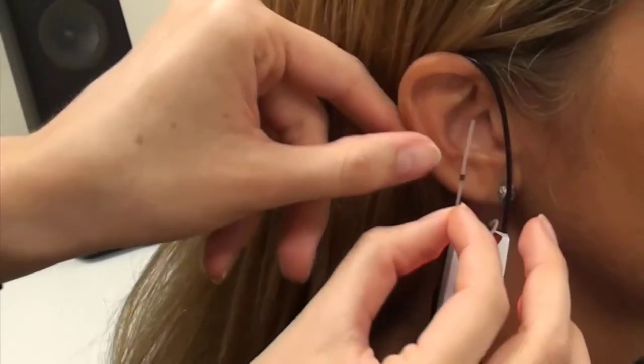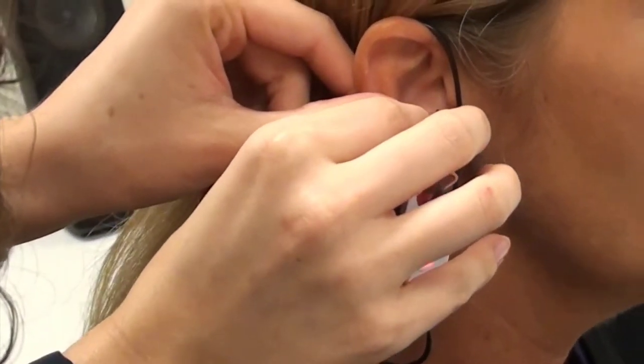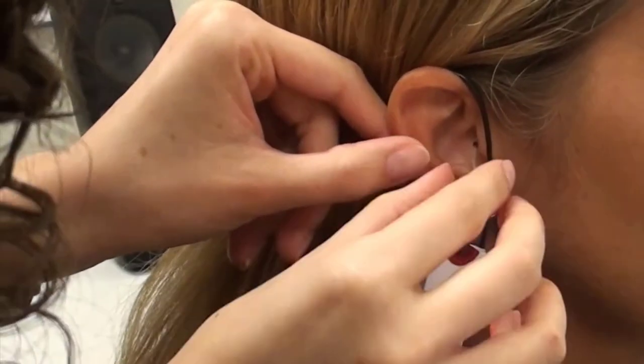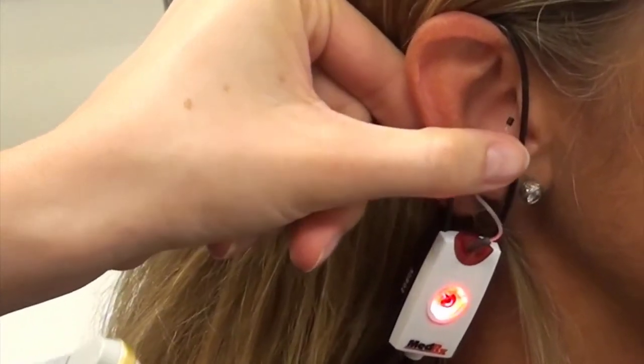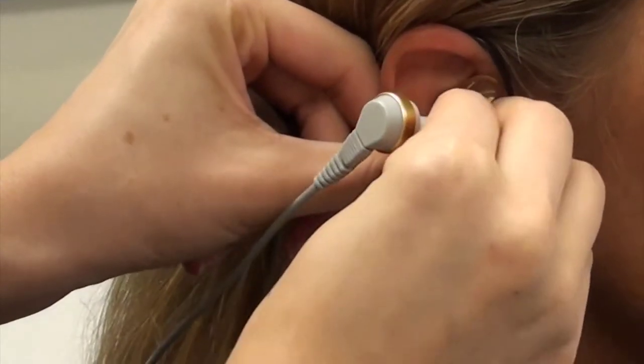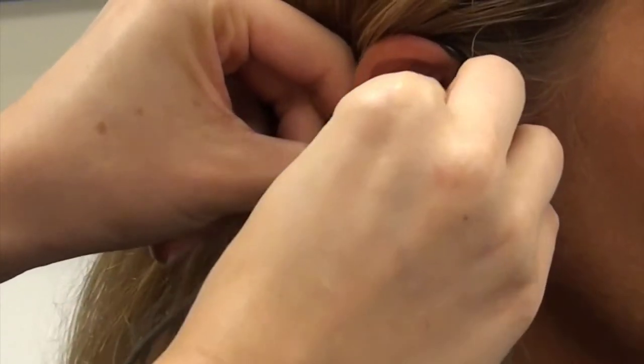Place the probe microphone tube as for all real ear measurements. Next, place the ear mold with the button receiver attached into the ear.